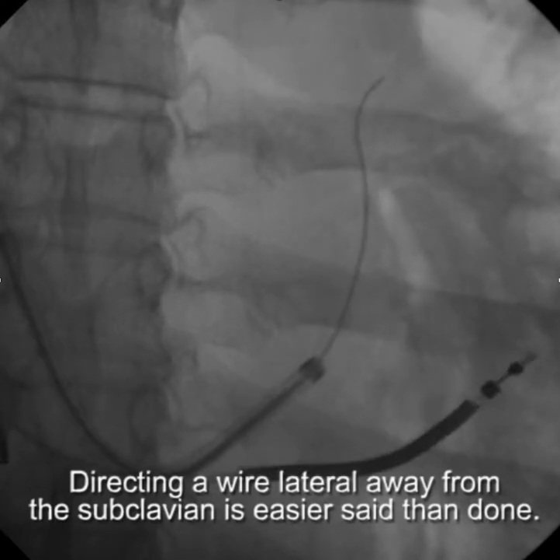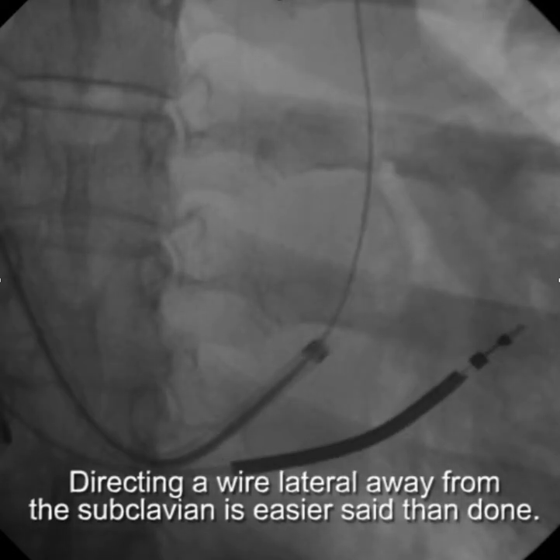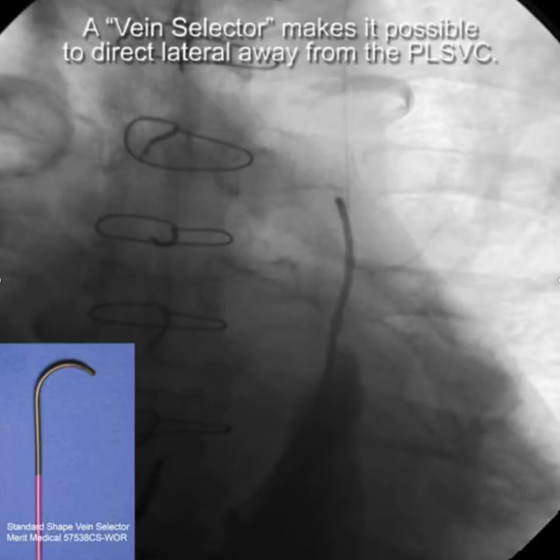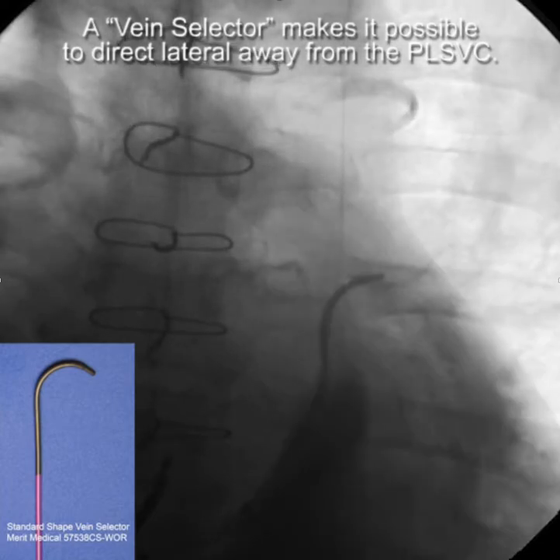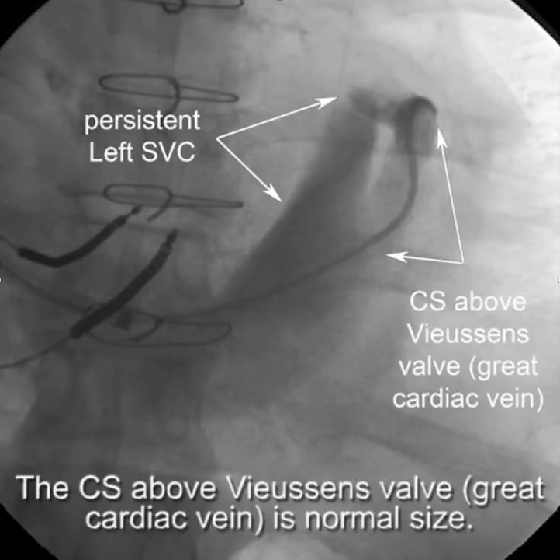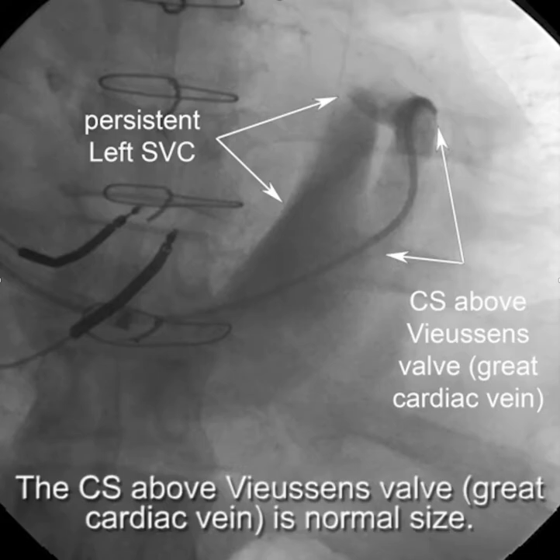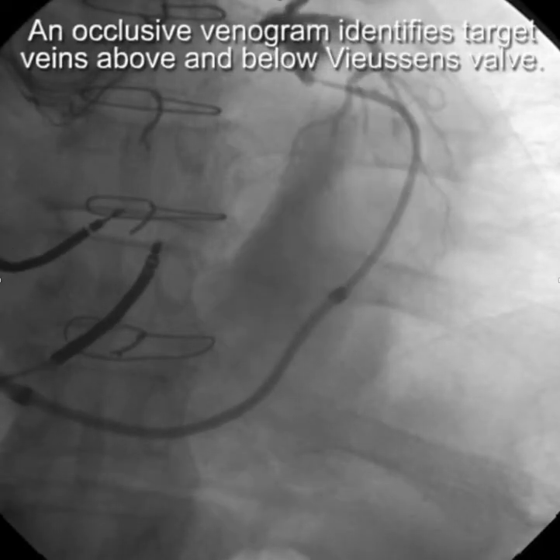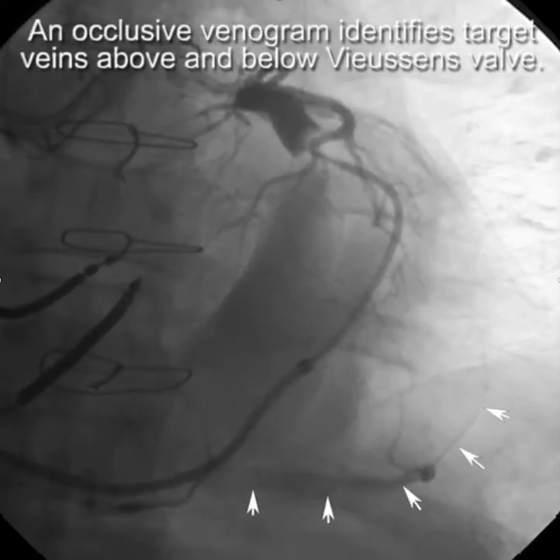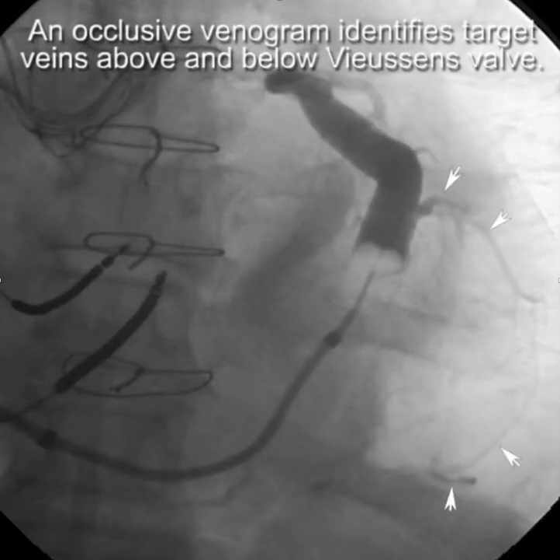Directing a wire laterally away from the subclavian is easier said than done, as illustrated here. However, the vein selector makes it possible to direct laterally away from a persistent left SVC. Here you can see the persistent left SVC in the CS above Vucin's valve, which is technically called the great cardiac vein. An occlusive venogram performed above Vucin's valve in this case identifies target veins below off the dilated CS as well as target veins above Vucin's valve.